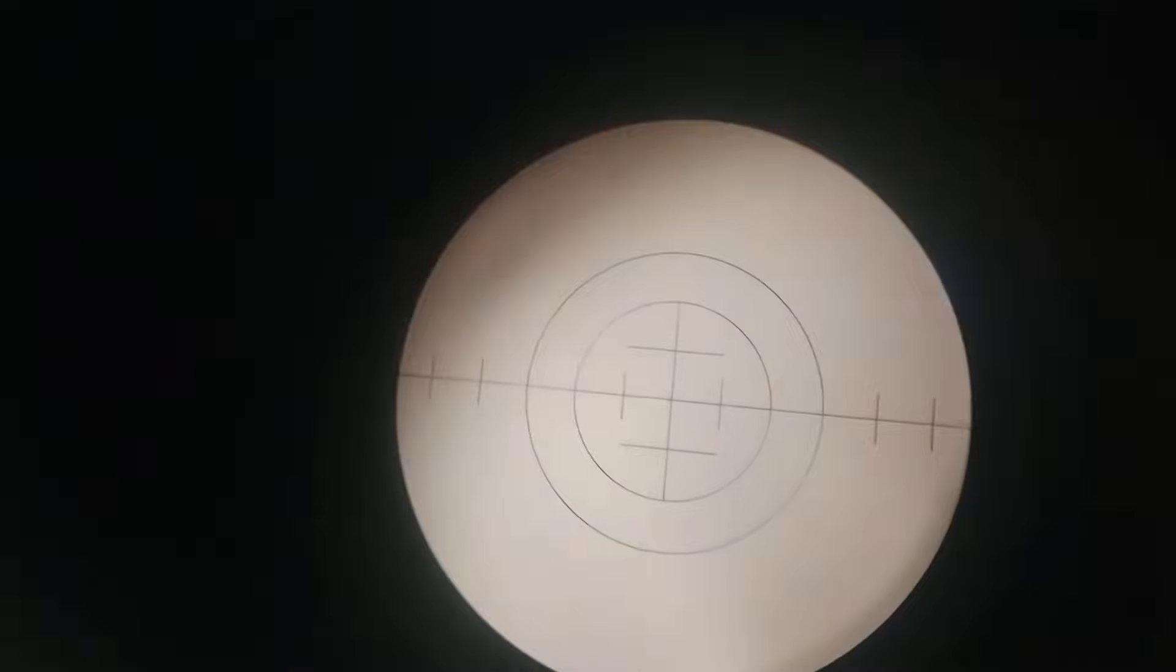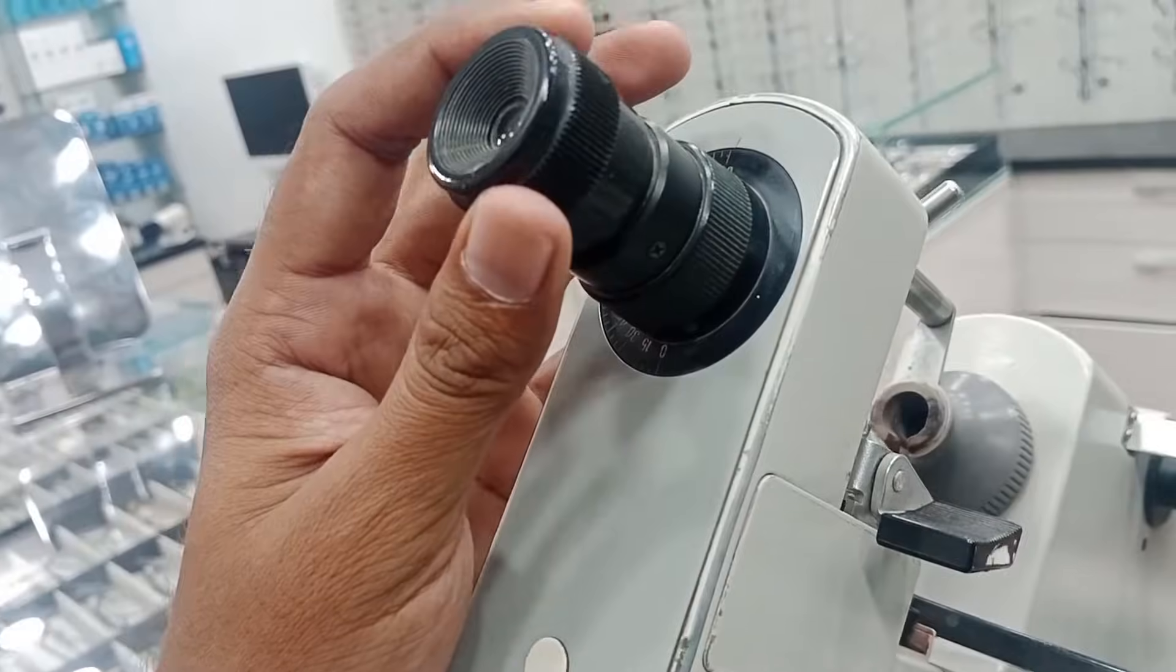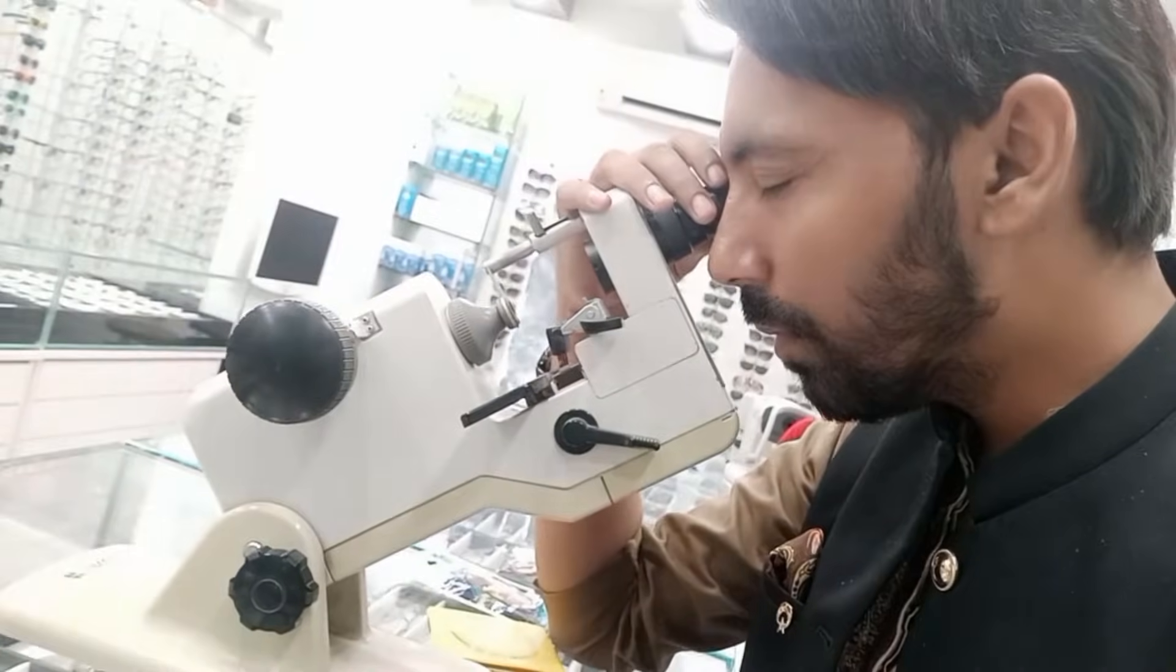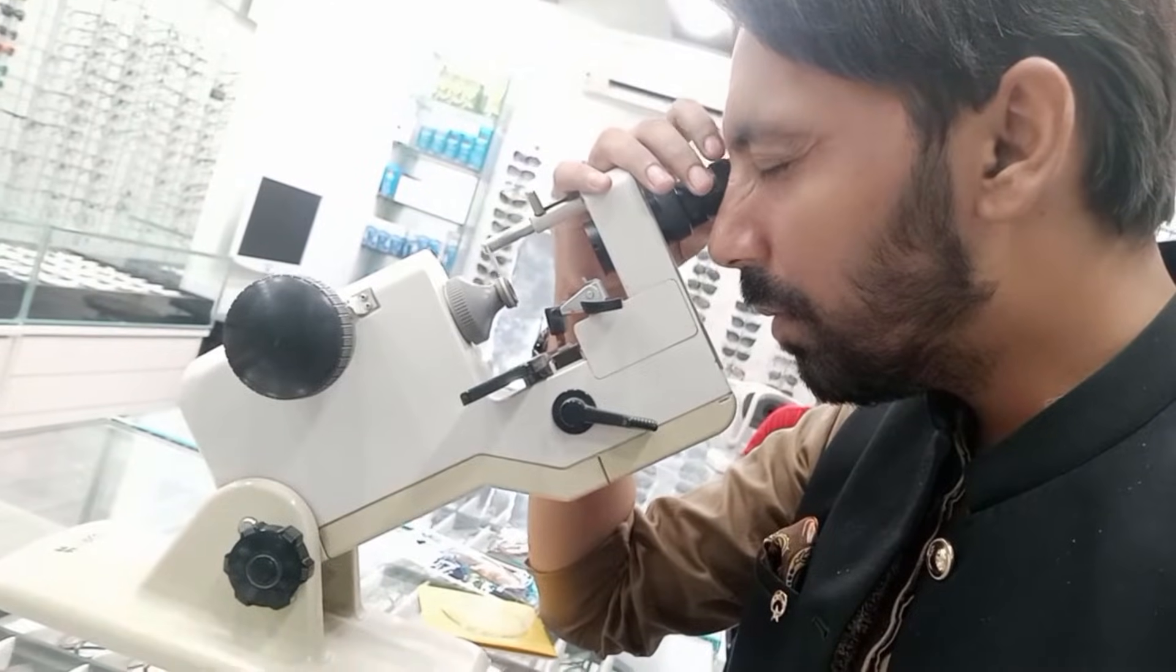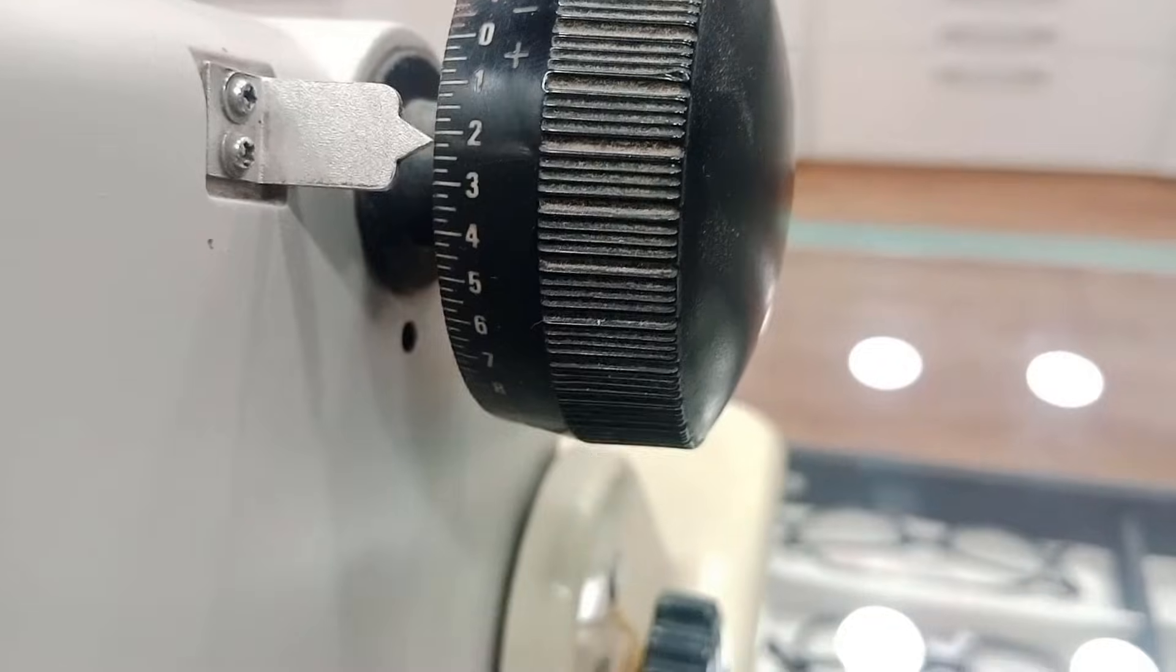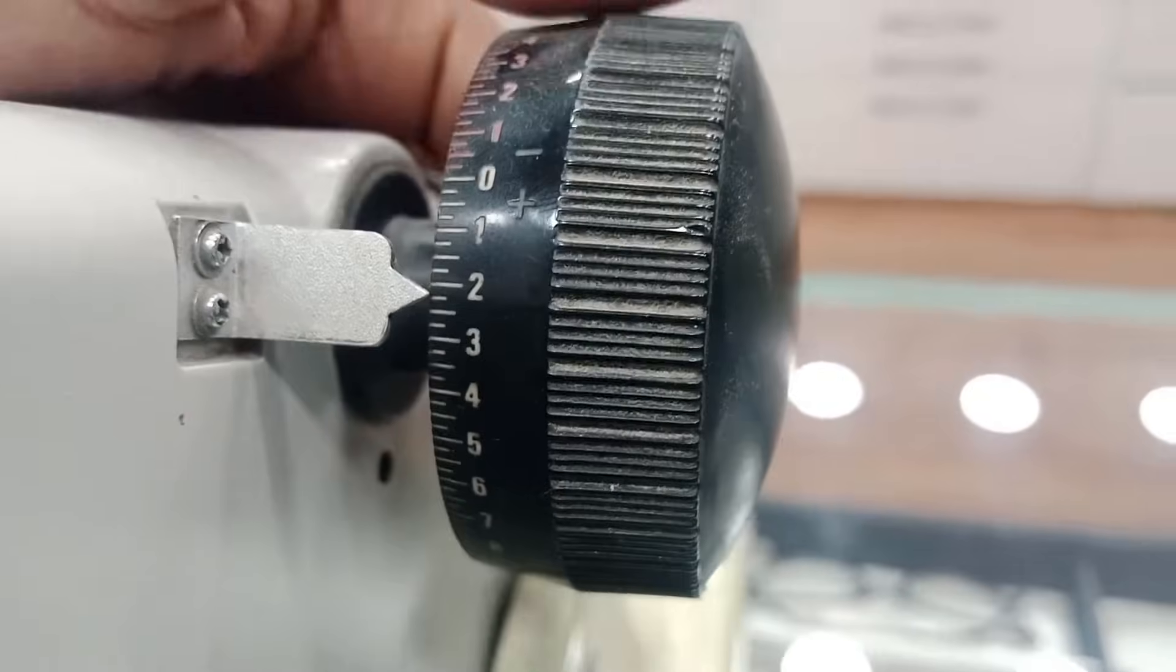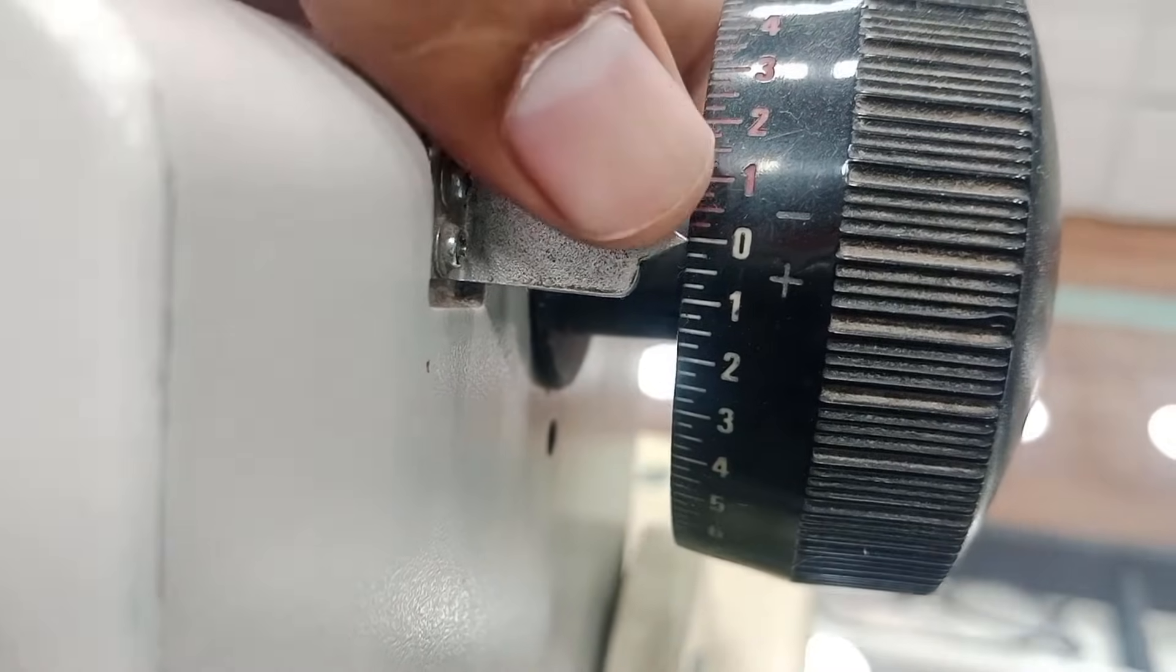Let's have a look inside. This is the graticule, and you can clear the graticule with the eyepiece. First of all, you have to clear the graticule inside by rotating the eyepiece, and your power dial should be at zero before starting the lensometry.